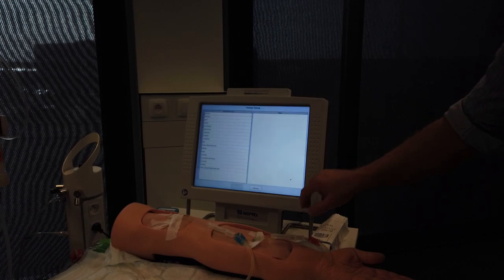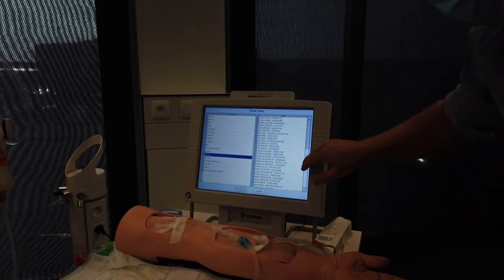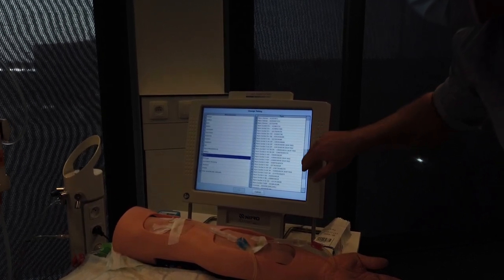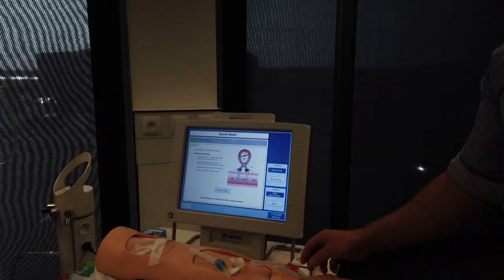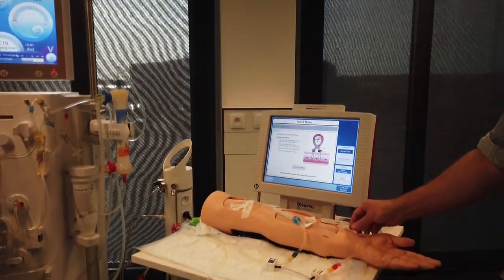Start with the access flow measurement. If a different bloodline than for the last measurement is used, select the correct bloodline from the blood tubing database. Follow the screen prompts, stop the blood pump, close the clamps on bloodline and needles, and reverse the bloodlines.